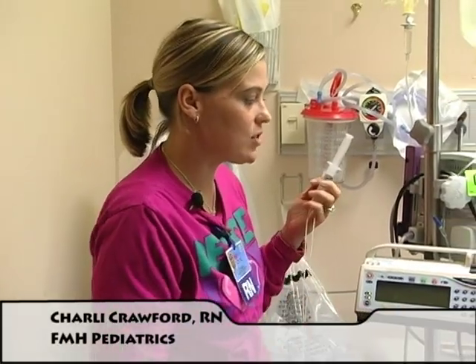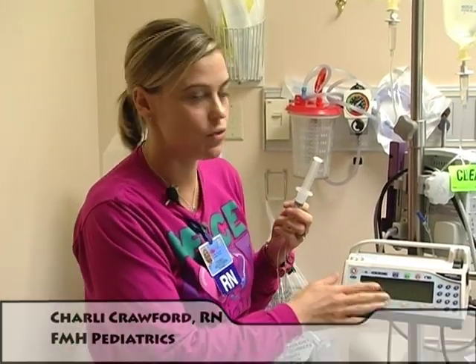Hi, I'm Charlie. I am going to demonstrate the use of our Medfusion syringe pump.